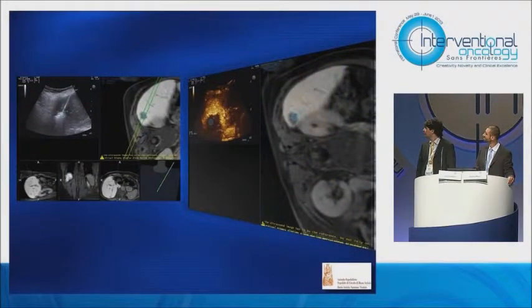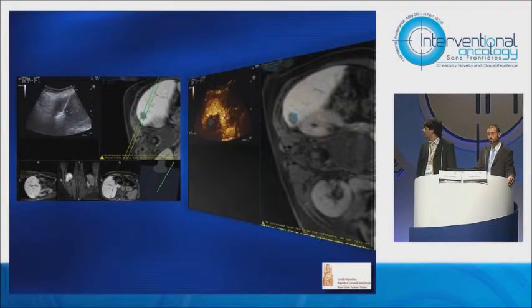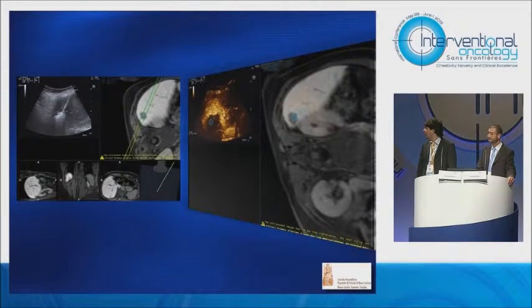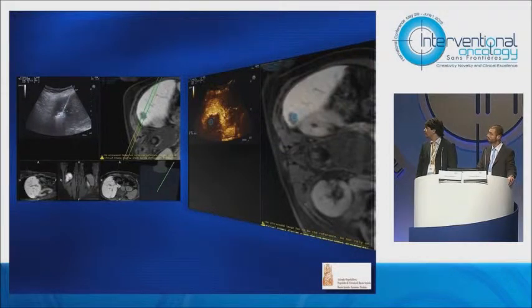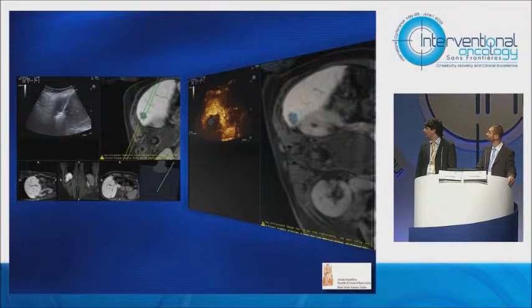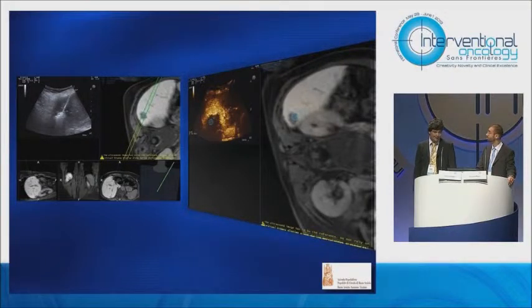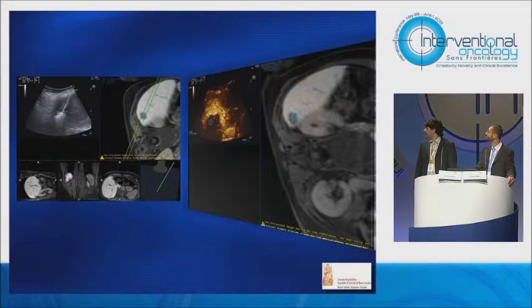On the left you can see the ablation of the tumor visible on MRI. After the treatment, by injection of contrast in ultrasound, you can see the zone of ablation completely covering the zone where the tumor was present on MRI.